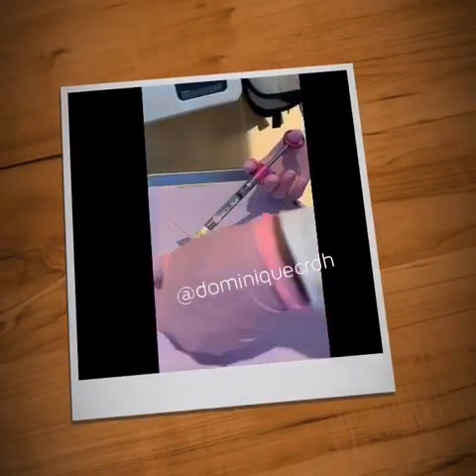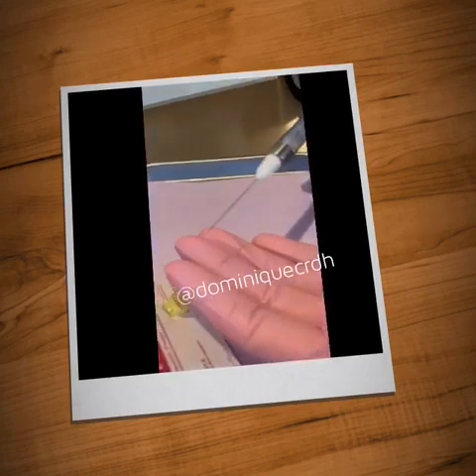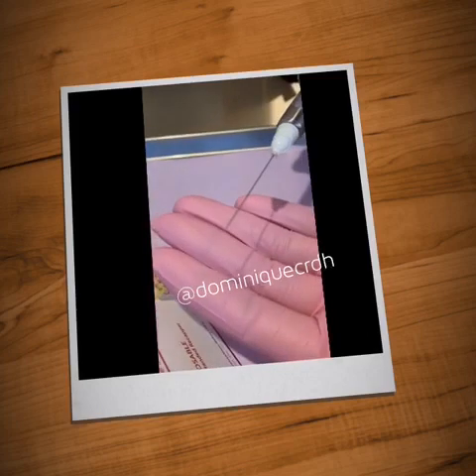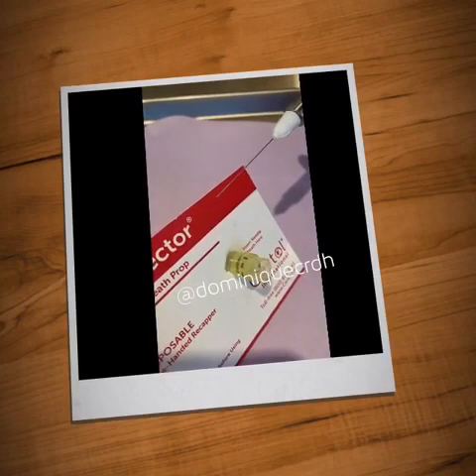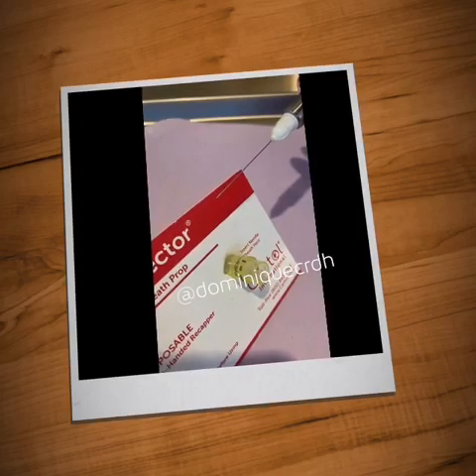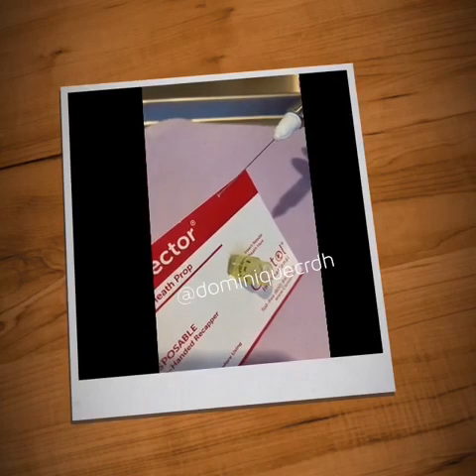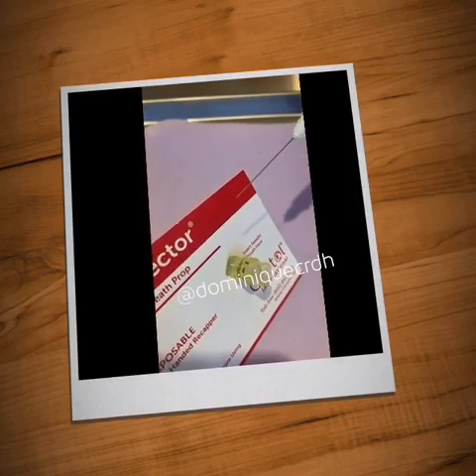Okay, we are now ready to perform the aspiration test, and you want to just remove the cap of the needle. I'm going to try to zoom in so that you can see the tip of the needle and the bevel so that we can do the aspiration test. The aspiration test is done by slightly pushing onto the thumb ring of the syringe so that a small drop of liquid is seen. Then you want to aspirate by pushing back on the thumb ring of the syringe so that the liquid goes back into the shaft of the needle. I'm going to zoom in and perform this several times, and this is an important step so that you can make sure that the syringe is ready.